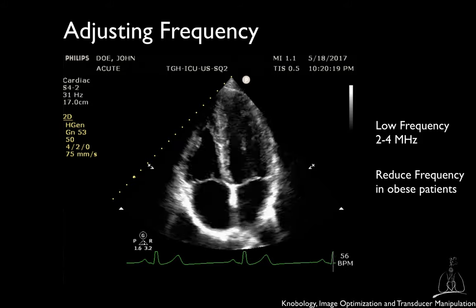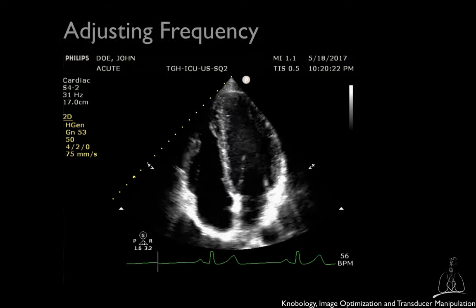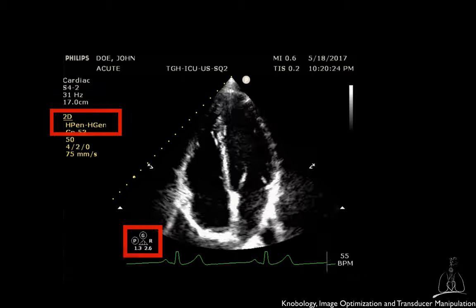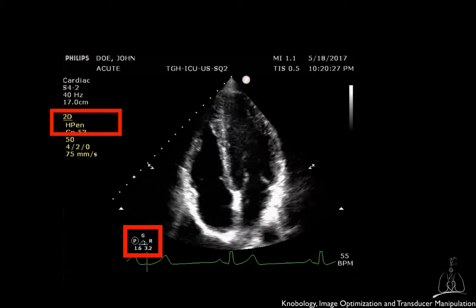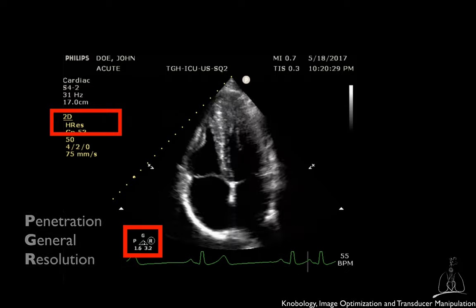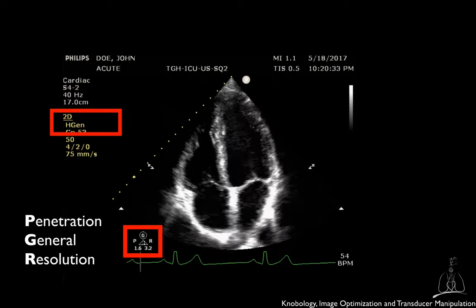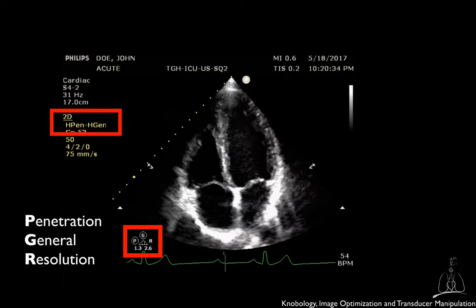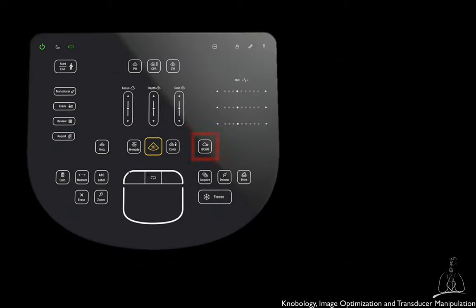Each probe has a range of frequencies that will allow better resolution or penetration. This is usually depicted on the screen with the triangle P, G, and R, standing respectively for penetration, general, and resolution. Most of the time the default setting is general. Finally, most machines also have a button that allows you to go back to the default setting.